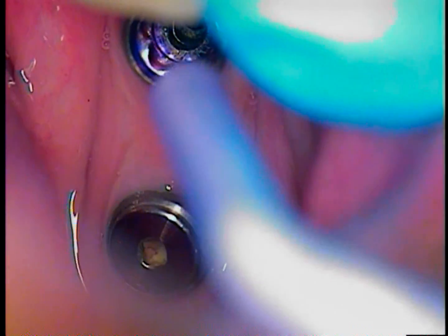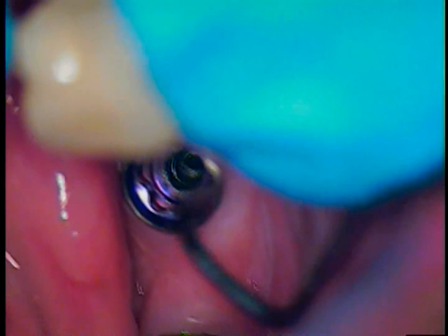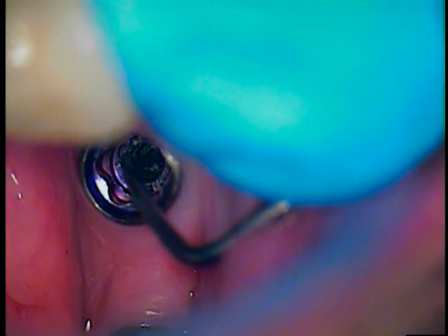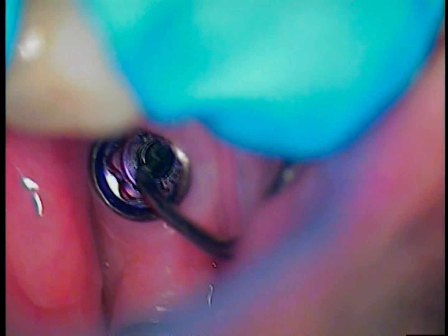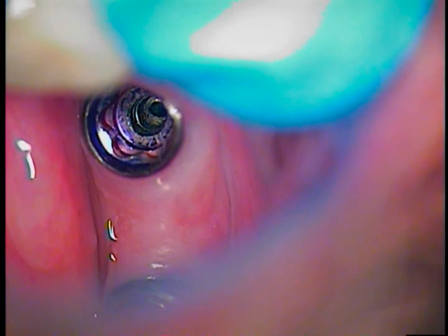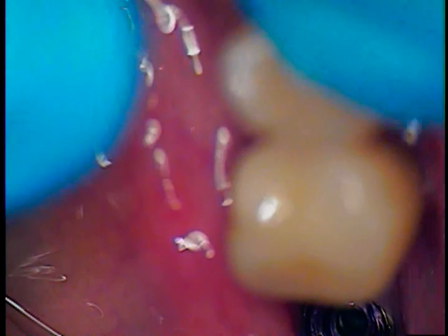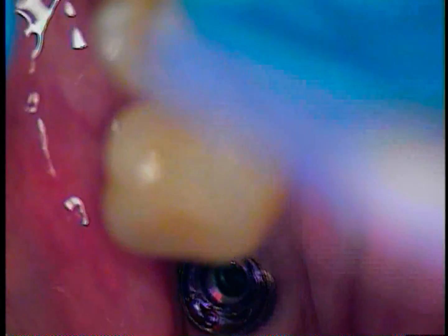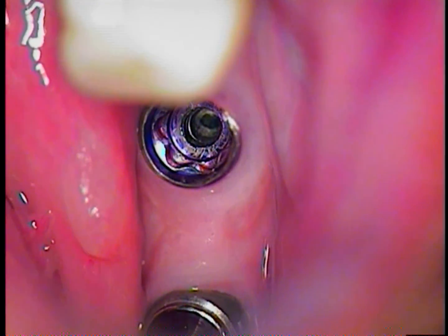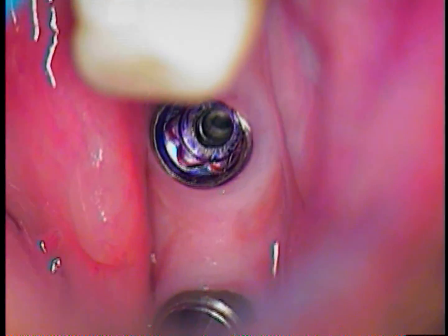And so now we'll have to check it. And you can see the slot again, I'm just checking to see if there's been any movement. Actually there's been a little bit of movement, so we've got something going on here. We do definitely have some movement and it did take us a little while. Finally you can see the lip inside now, see it reflecting light, that little lip inside. And so we can zoom in on that, actually we're going to go ahead with the driver again and try to go back and forth a little bit, lock it in and turn.